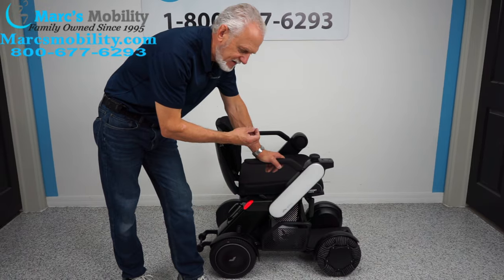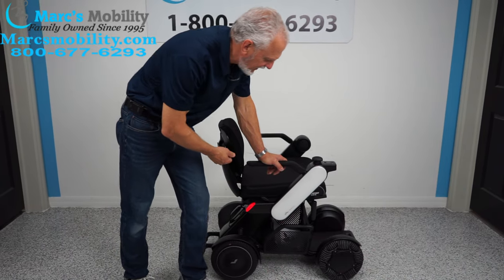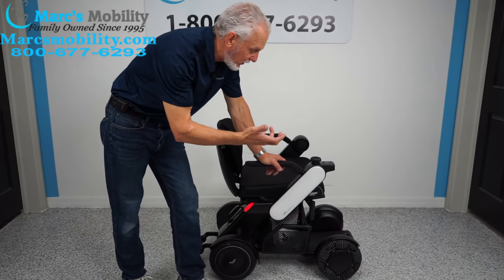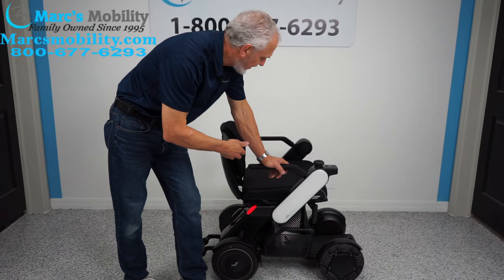If you're looking for the next futuristic, advanced technology and you want to be one of the few with a chair like this with the latest technology — and if you have a loved one you need to transport using your phone — this would be a great, great way of doing it.